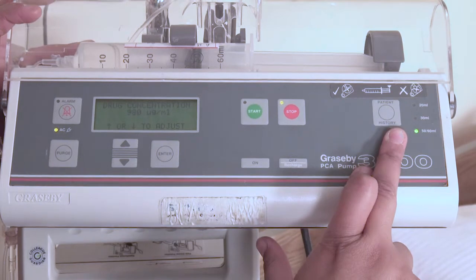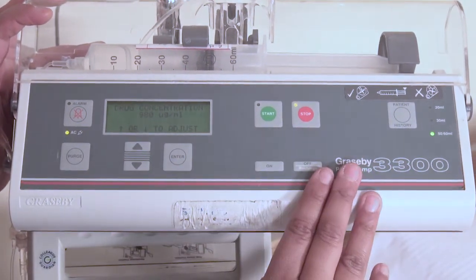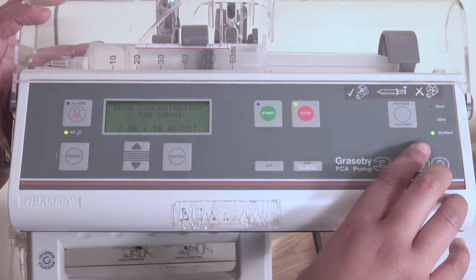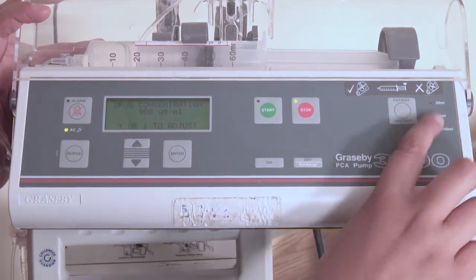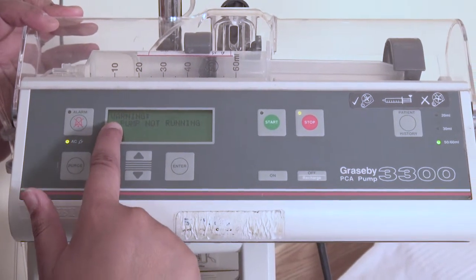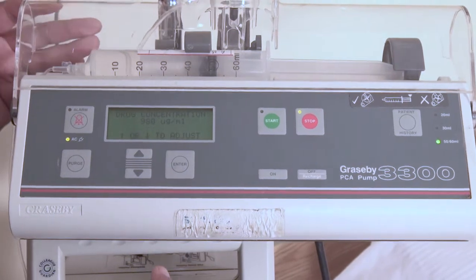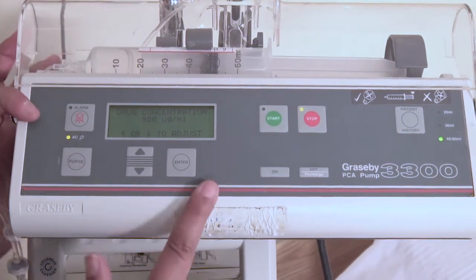Patient history allows you to see what the patient's been doing as far as administering their own dosages, and then the type of syringes that you're using. If you close it, it'll tell you warning, pump is not running, and you're not able to program anything. So it has to be open and unlocked to program.